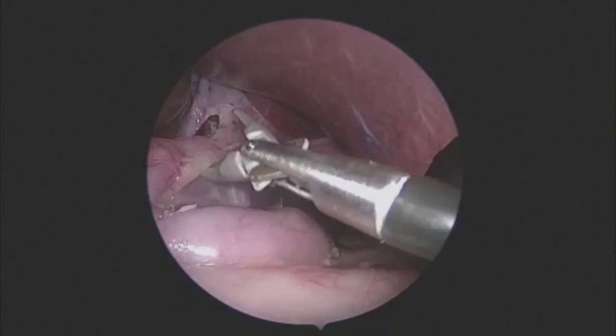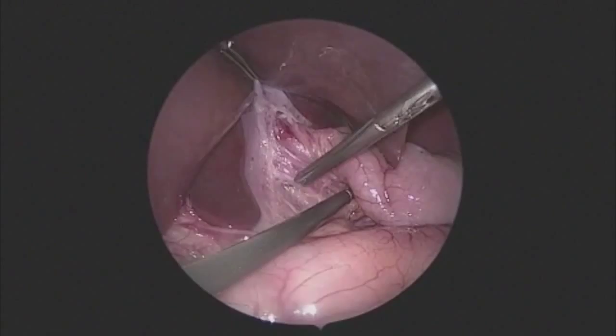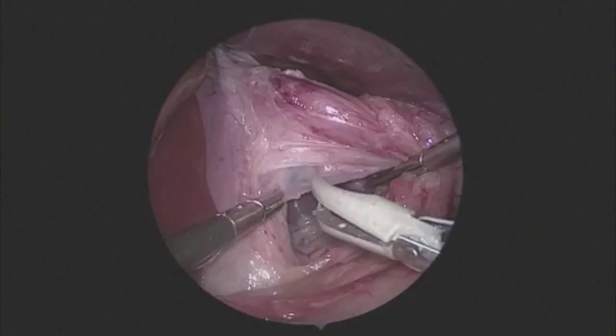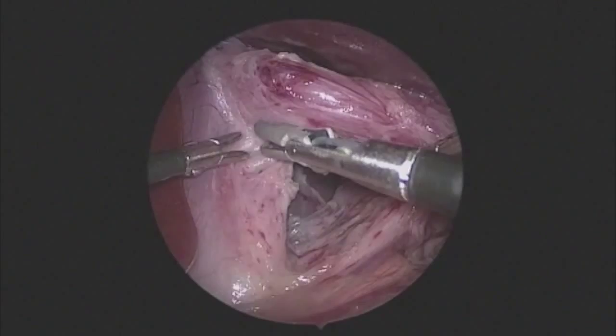You can see how well we can grasp tissues and dissect with the three millimeter sealer without needing an instrument change. Once that part of the dissection is complete, we go to the posterior window. It is important to make sure the vagus nerve is up along with the esophagus — this is a very blunt move to ensure we do not injure the esophagus or the posterior wall of the stomach. Some mild attachments are taken with the sealer to better expose the left crus, confirming a good length of intra-abdominal esophagus.